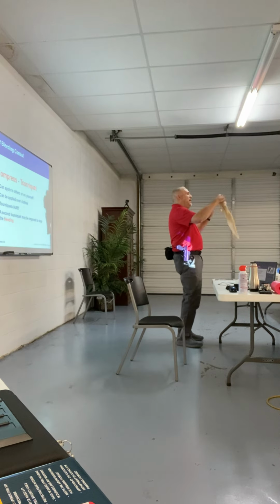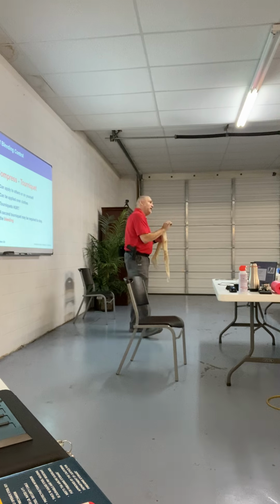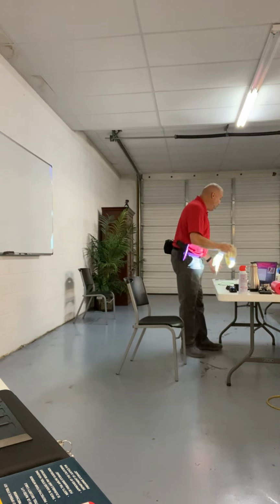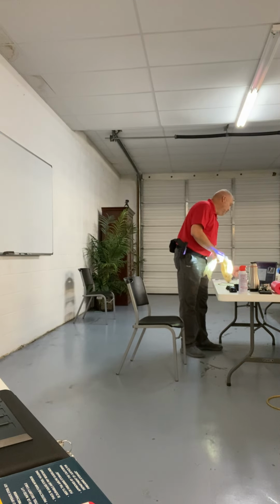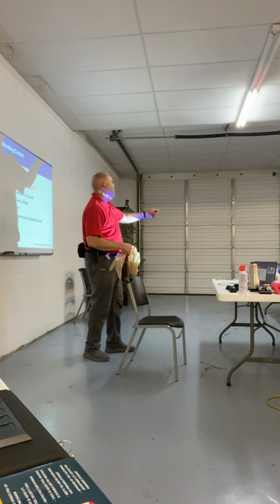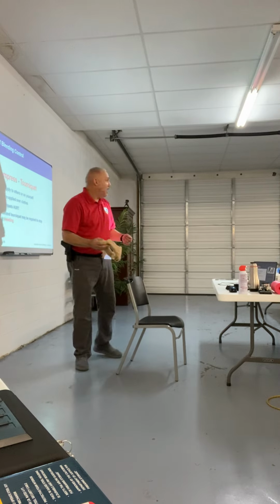So 1.5 to 2 inches. That width is very important. You get anything smaller than that, and you will not cause enough compression to stop the bleeding. But like I said, there are tons of things y'all can do at home. And that might be an exercise y'all do one day. Hey, let's find out what we can use as improvised tourniquets. You go use the bathroom, I'm going to the kitchen. You come out and meet and say, hey, this is what we got, right?